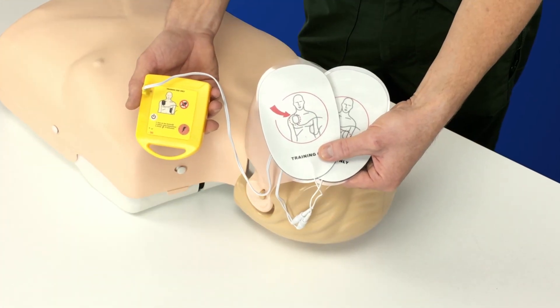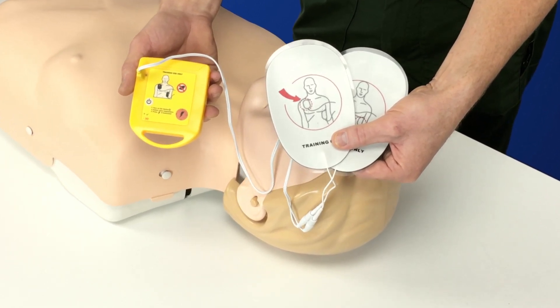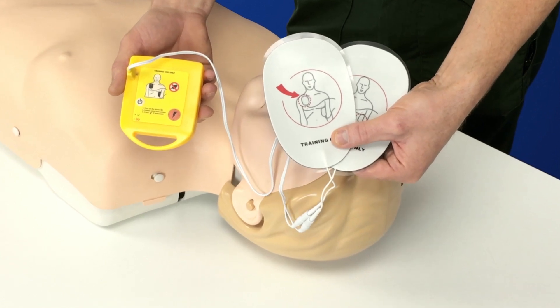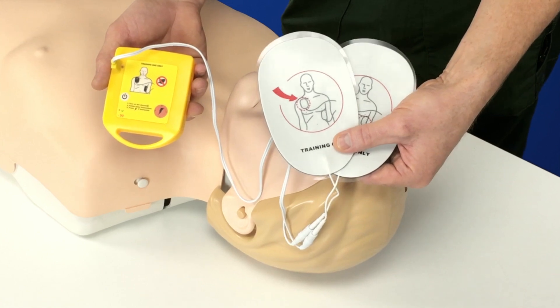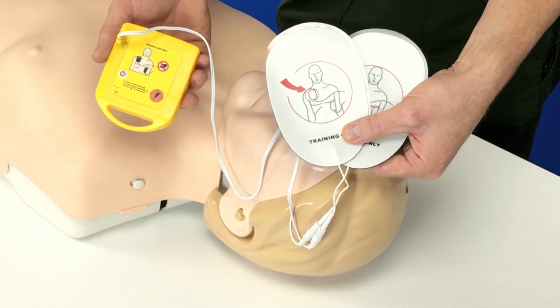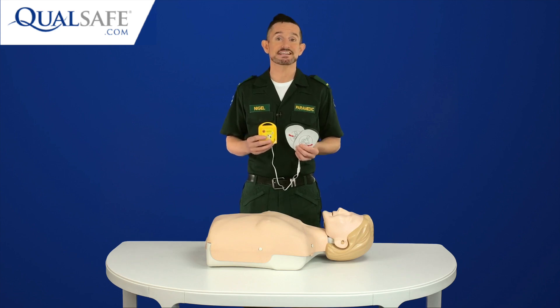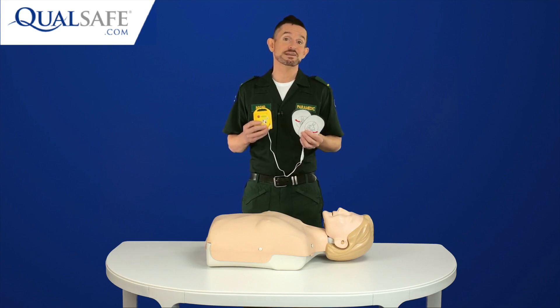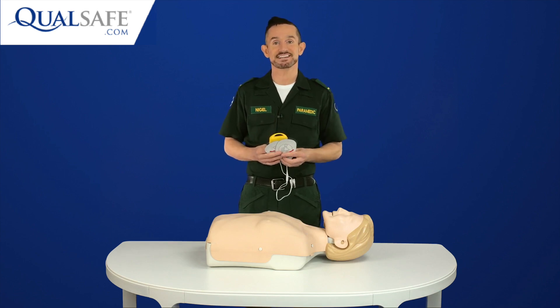One of the great features is its size. First aid trainers have enough equipment to carry around without adding further kit, so the Mini AED Trainer is so small and lightweight you can literally store one in the bag with each of your CPR mannequins. Of course, it's sensible to have at least one life-sized AED Trainer to show your class, but the Mini AED Trainers are fantastic for enabling every student to practice using an AED.